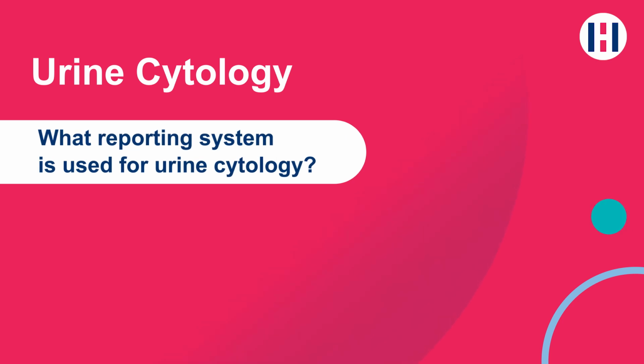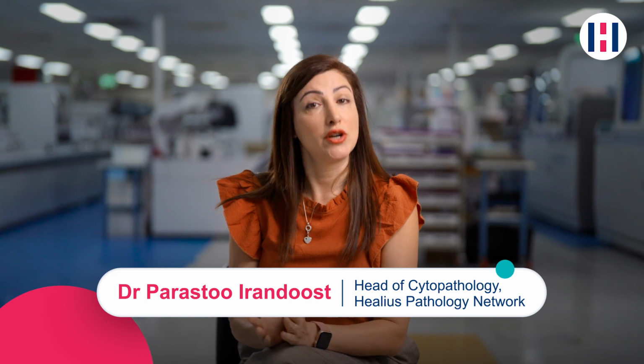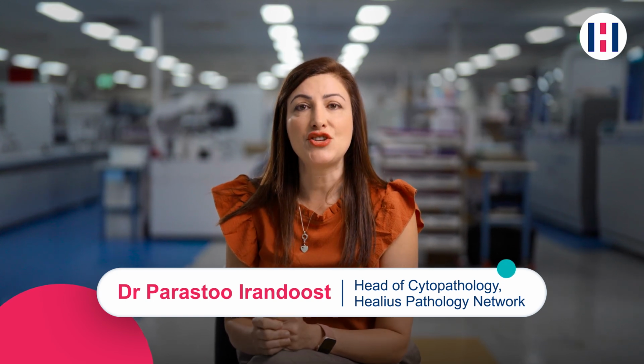So now that you're familiar with the case, let's take a closer look. The Paris system, which is a standardized universal system, is used for reporting urine cytology. Its focus is detecting high-grade urothelial cell carcinoma, and it uses key features such as nucleocytoplasmic ratio, chromatin quality, hyperchromasia, coarsely clumped chromatin, and membrane irregularities to classify the specimen into 5 distinct categories. For each category, there are clear guidelines with regards to follow-up and management of the cases.